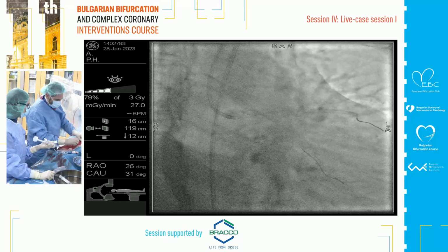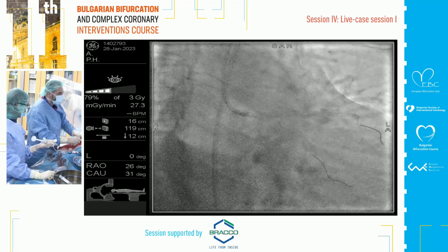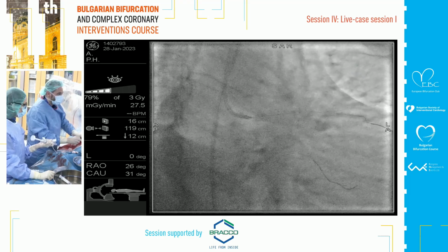If they reuse the one or... Yeah, the wire is probably twisted. Okay.